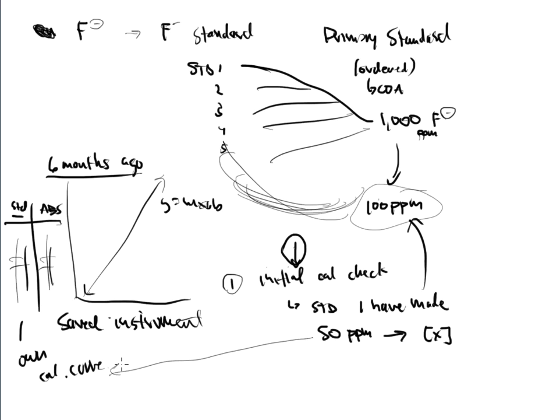And I'll tell you a secret. It's not really a secret, but in a laboratory environment, the instruments will keep and do the cal curves for you. You will not be generating your own Excel spreadsheets as far as cal curves go. You might have some as a backup, but the instrument does a perfectly fine job creating calibration curves and plugging your samples into those calibration curves to give you a concentration. It does quite a bit of the work for you. So this is the purpose of the initial cal check.